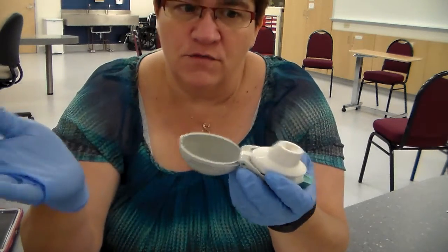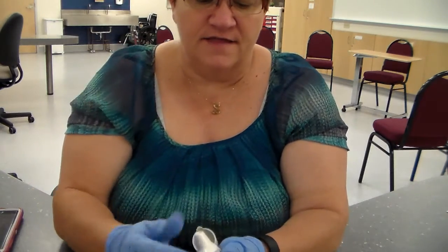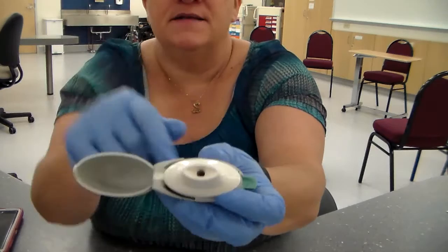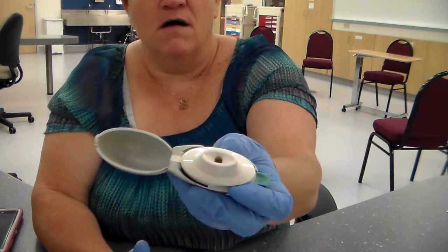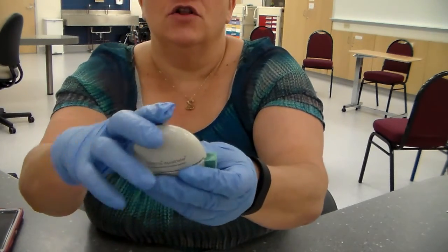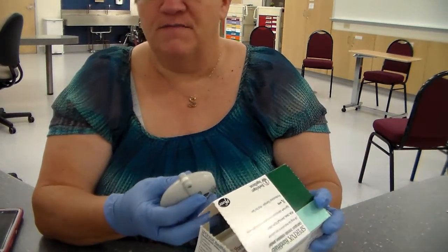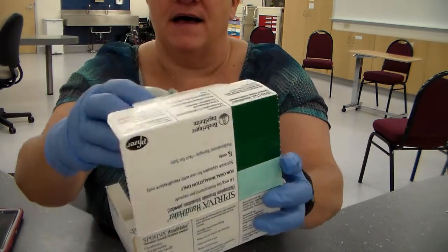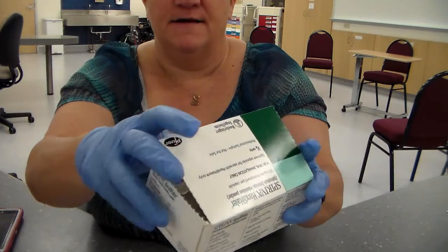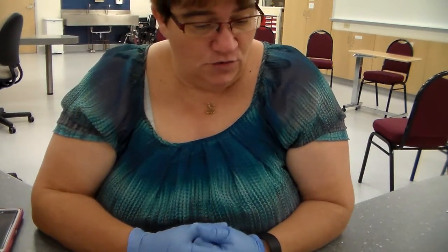When they're all done with this, you remove the capsule from inside of the inhaler and put it in the garbage. Then you're going to clean off the mouthpiece. Alcohol, tissue, alcohol is probably the best. Then you're going to close the container and store it back wherever you keep it. Generally, they like to keep it in the same box as the medication. So you put the inhaler back in with the medication, and then you would store that wherever your facility stores it.